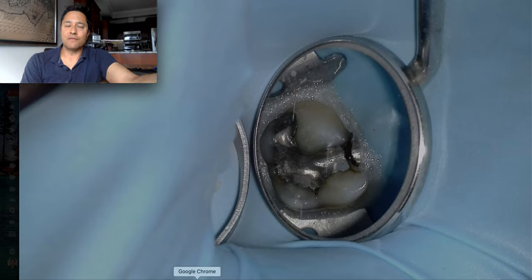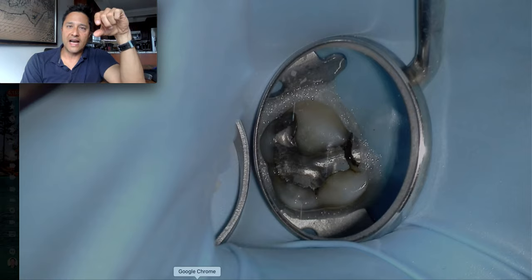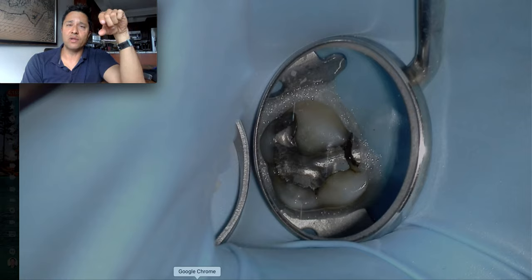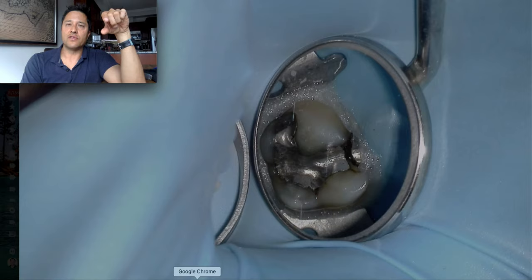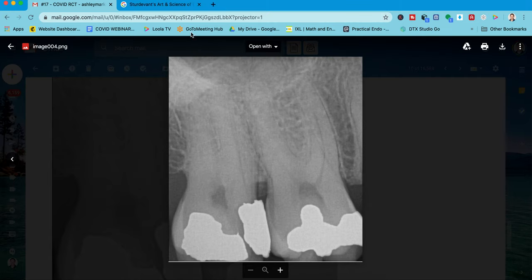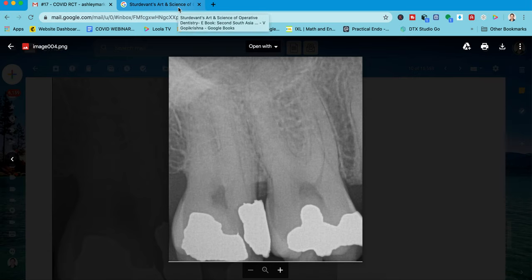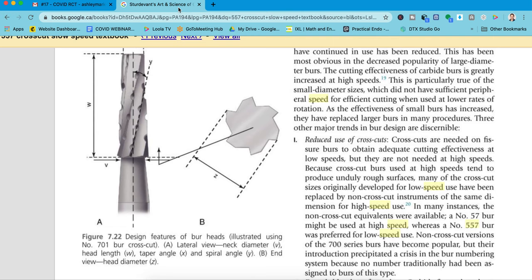The crosscut fissure burr. I remember looking in my supply room, looking at this old latch burr from like 1959, thinking, why do we have this slow speed 557 crosscut burr? And sure enough, here we are in 2020 using this technology back from 1969 or whatever it is.